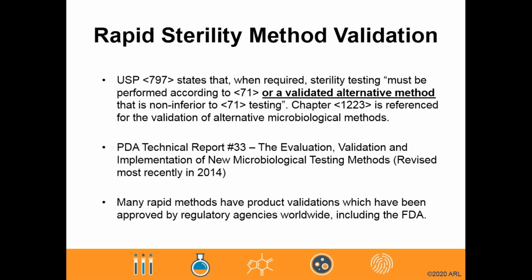Moving forward to one of the next goals of our webinar today, we will discuss rapid sterility method validation. Perhaps the most important facet of employing a rapid sterility method is confirmation that a thorough method validation protocol has been completed. All of the systems mentioned during the previous slides have undergone full validations by their respective vendors, as well as numerous labs around the world.